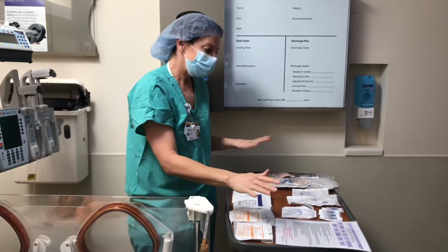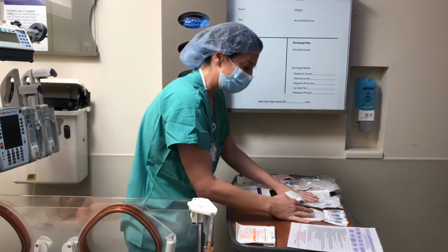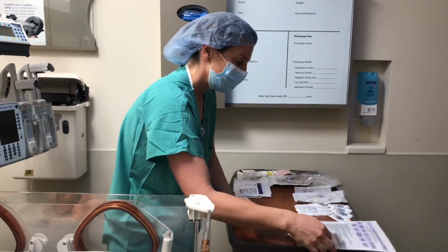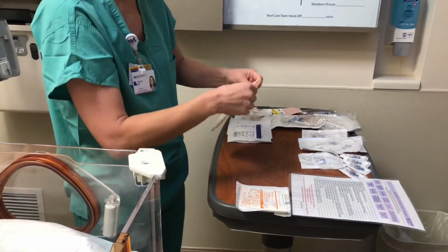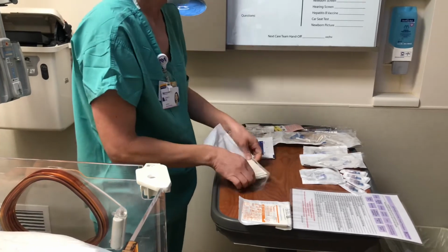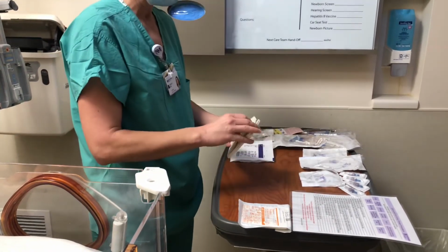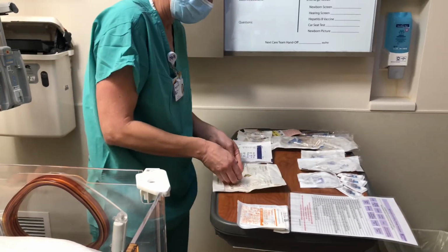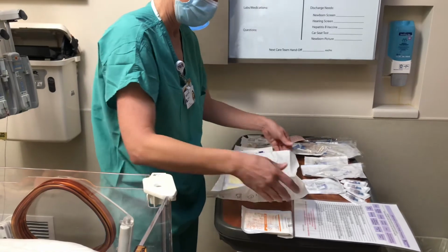And next, I'm going to open my sterile gloves, and I like to make a little area for myself to kind of work here. And you see, you can leave your tubing change procedure right here so you can follow it along as you go. So I'm going to open my sterile gloves, and I'm going to use this wrapping as a sterile field on my table. So again, just kind of make yourself a little work area.